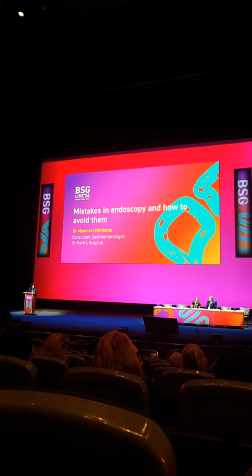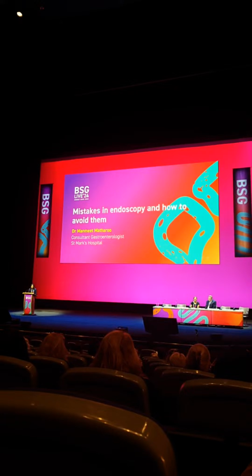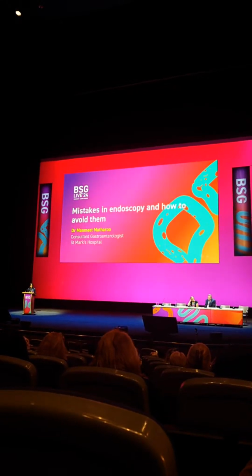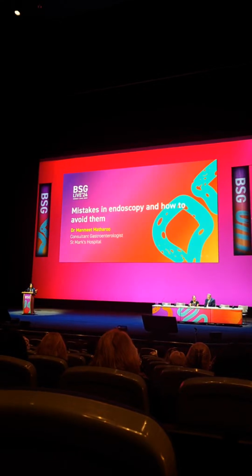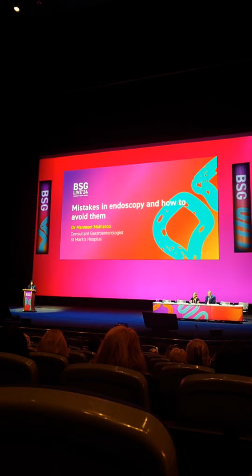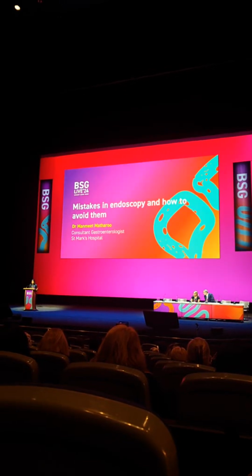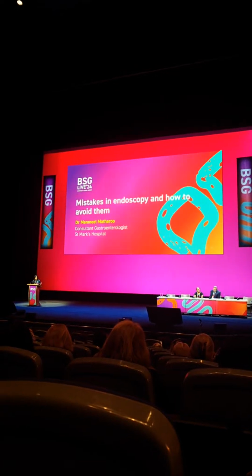Any comments on right colon retroflexion? Yeah, so I think it is a good way of making sure that you optimise your views. I think you have to think about doing it safely wherever you do retroflexion, and thinking about why you retroflex. Is it because you haven't got optimal views? Do you have an Endocuff on? Do you need to retroflex? Position change might help. But I think it's definitely a good way of improving your visualisation.